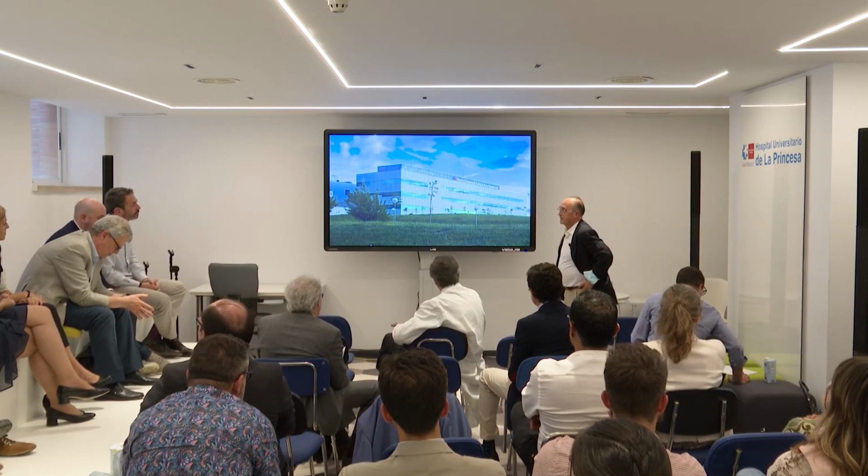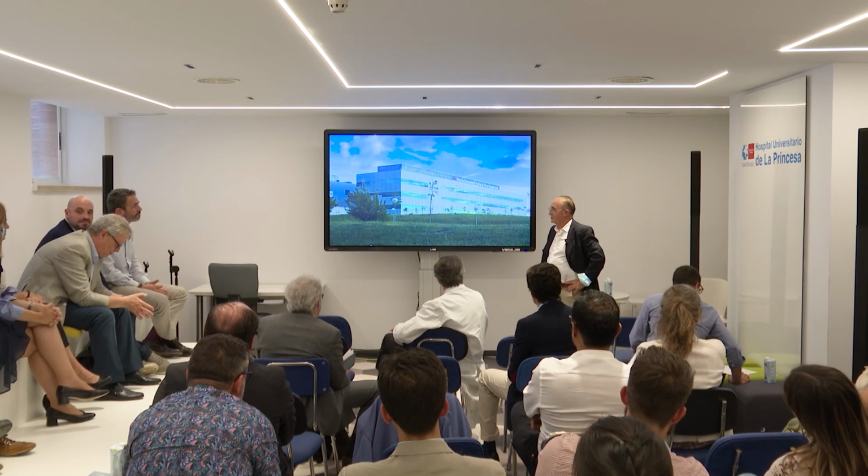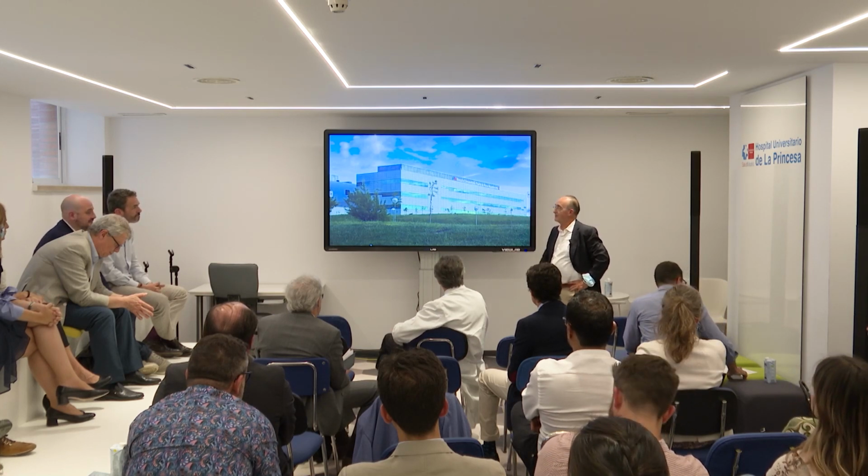Well, ISR was the original use, I think, the selective use for this cutting balloon initially in the late 90s because of slippage of the balloon. And actually, if you see the guidelines, that's what they say. I don't want to give more credit to the guidelines than they should have, but I think that's a good reason. I mean, you dilate where you want to dilate, and you have a fibrous plaque that you break it up and you may get a good expansion.